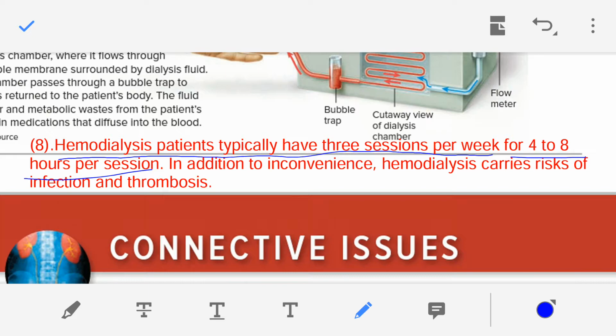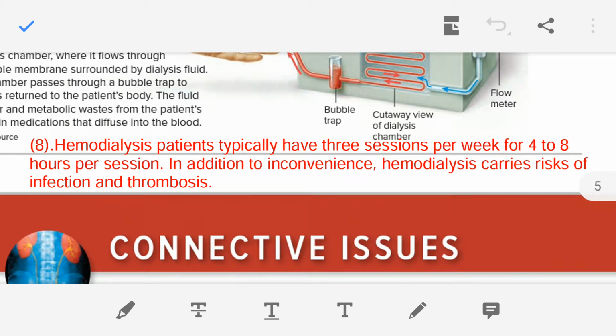Now, in addition to inconvenience, the patient who is on hemodialysis has a risk of infection, and the patient also faces a threat of thrombosis.